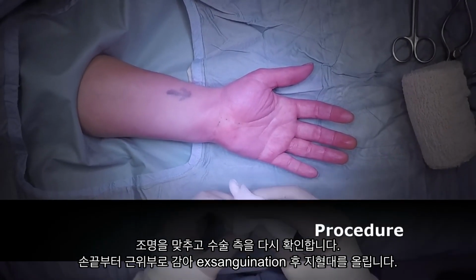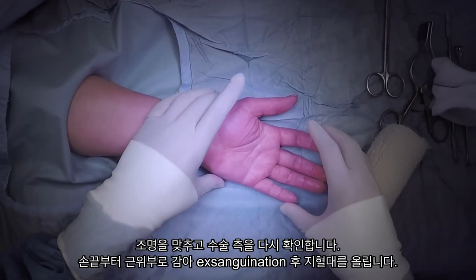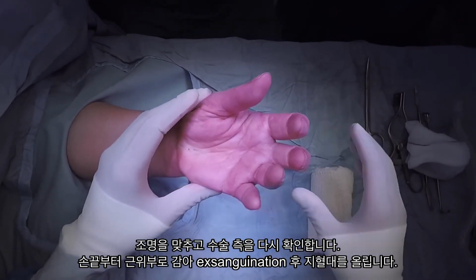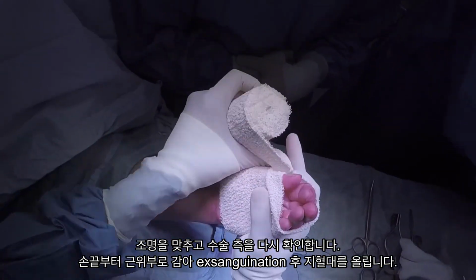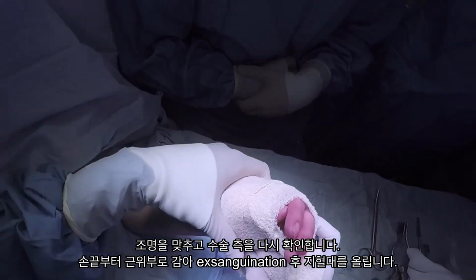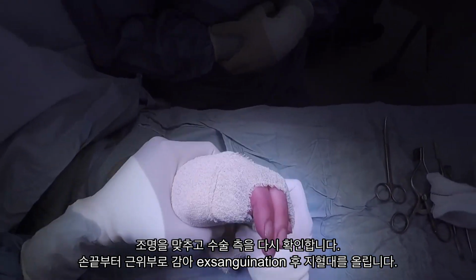Get your lights in position and double check that you're operating on the right side. Start by exsanguinating the hand. A crepe bandage wrapped tightly around the hand and forearm, starting at the fingertips and moving proximally will do the job. And once you've done that, inflate the tourniquet to 250 mm of mercury and then remove the bandage.